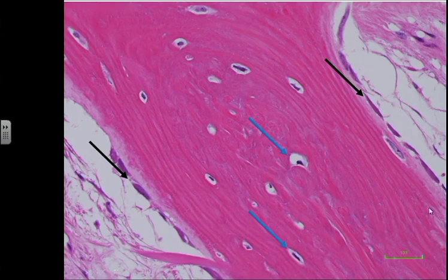So when we look at a mature, well-formed bone, which forms the adult skeleton, it is formed of bone matrix that shows this parallel arrangement of collagen. I'm going through the fibers just to highlight with the arrow over here and over here. These collagen fibers are parallel to each other, and we describe them as lamellar. They show a lamellar arrangement. Each fiber has a lamella, one line. The next one is parallel to it, another line. So they have a lamellar arrangement.